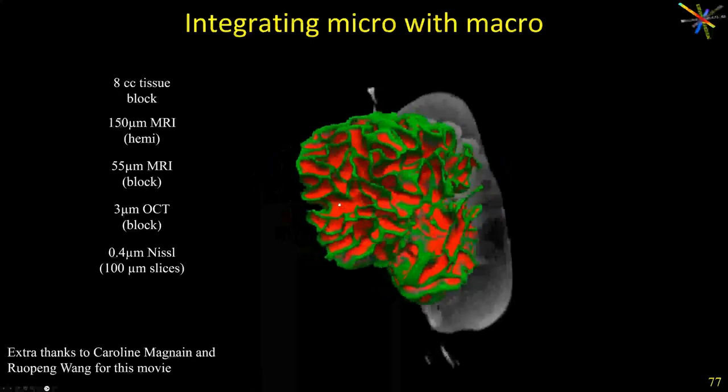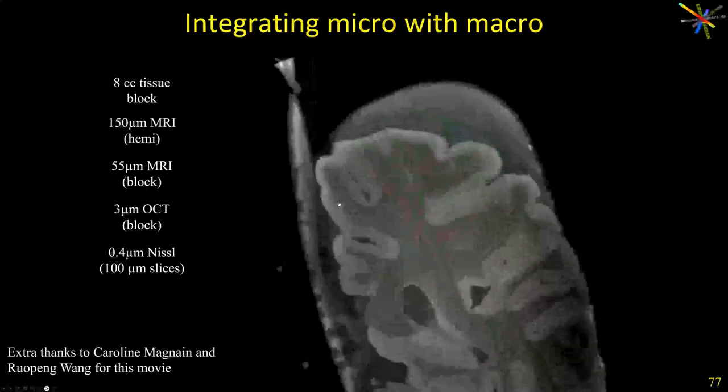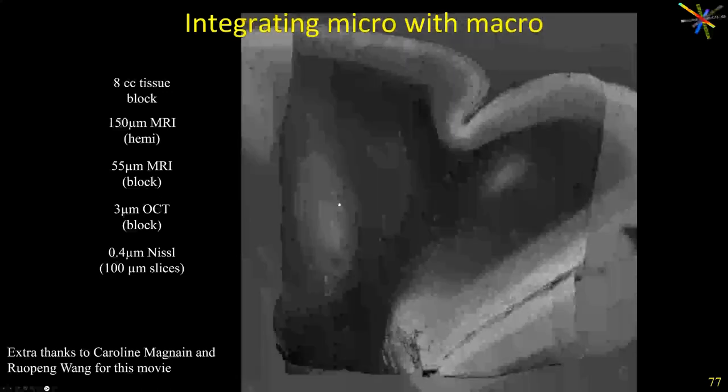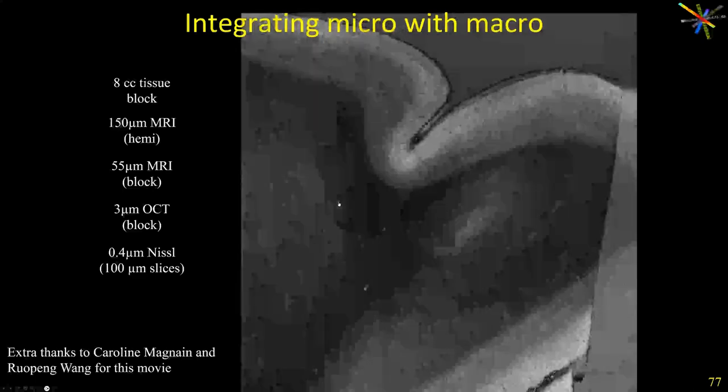So here we're starting from the outside, we see the surface model, then we see the 150 micron MR, and now we see the 55 micron MR, we go in further, we can see the 3 micron OCT, and then the Nissl stain projected into where it sits in the cortex.